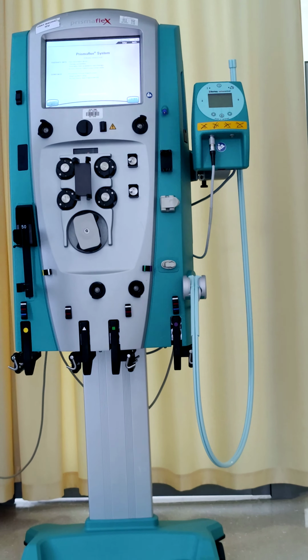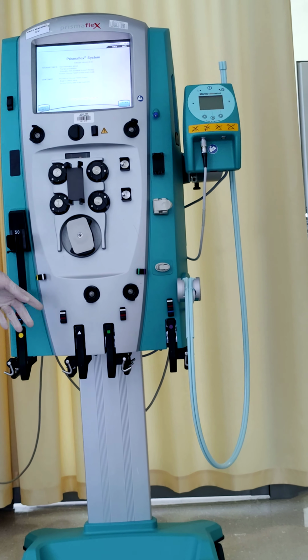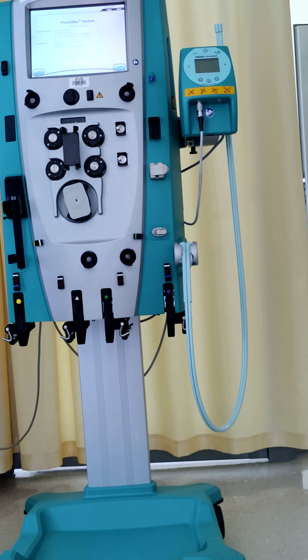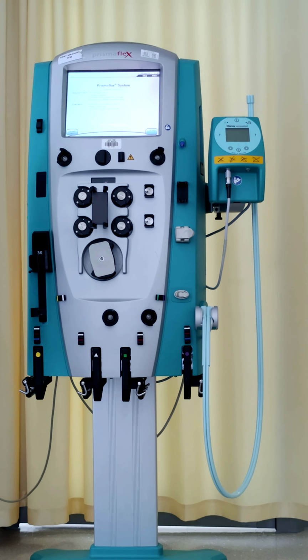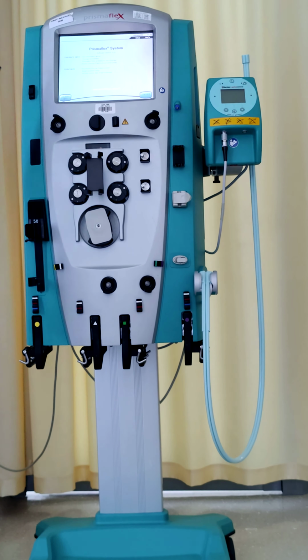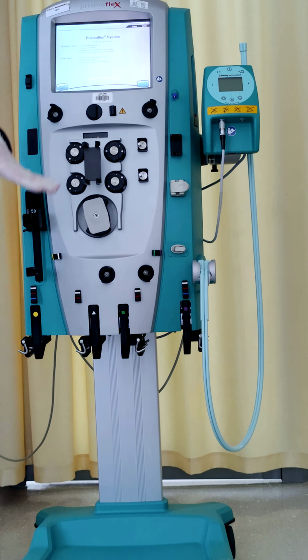The third one to mention is if you need to put any pre-blood pump solution or not. And that has to be equal to the replacement. I remember something like that, something has to be equal to the replacement. No, this is in the CRRT dose, dialysate and replacement, 1 to 1.